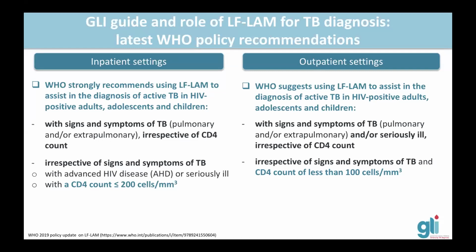And then if the patients present without signs and symptoms, or irrespective of signs and symptoms of TB, the lateral-flow LAM is recommended for use if the patients present with advanced HIV disease or are seriously ill, or with a CD4 count below 200.